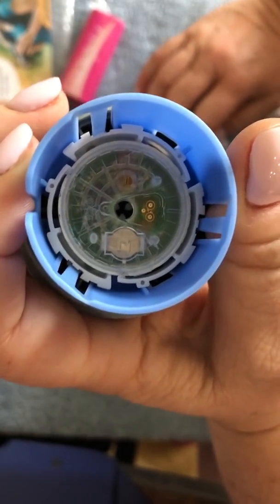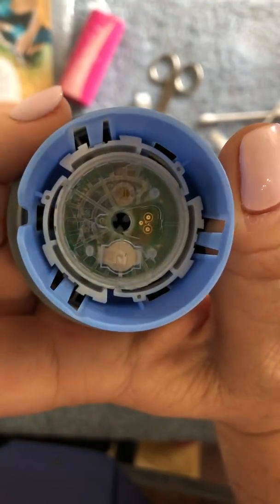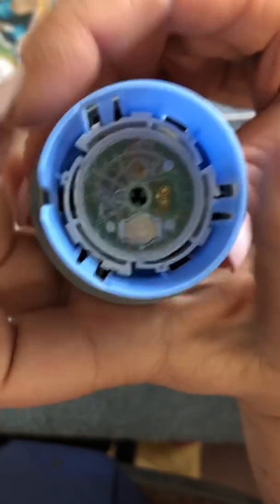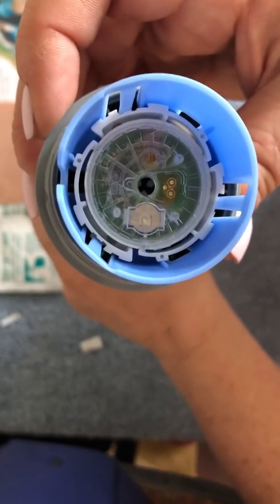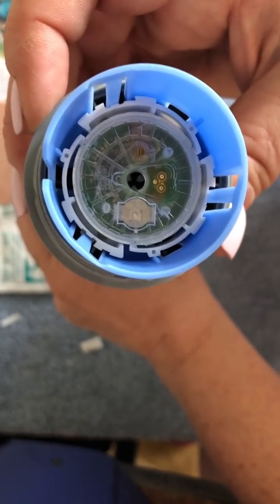When that's done, and you make sure that everything is lined up correctly, as I mentioned, you can snap it then into the needle. I'm not going to go that far in this video. I really just want to show you how to do that. But normally what you do is you would snap it like you normally do.